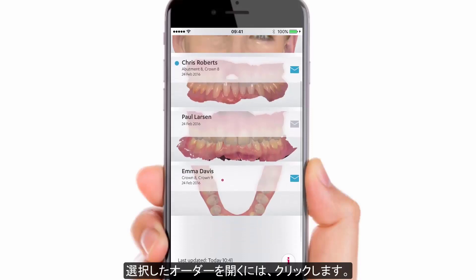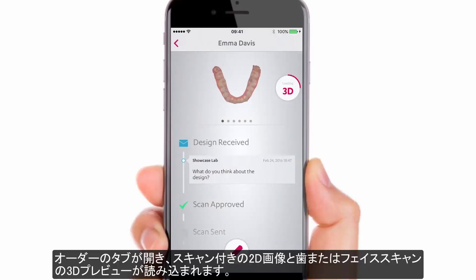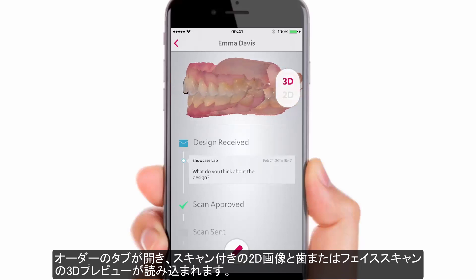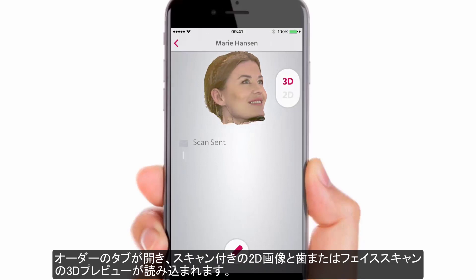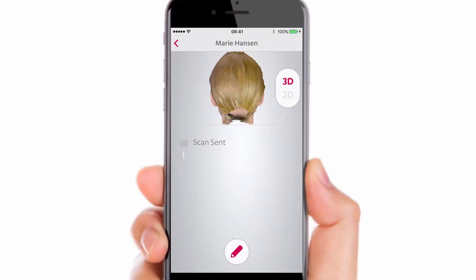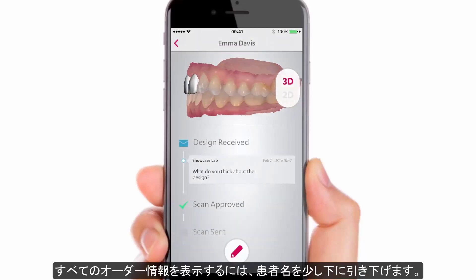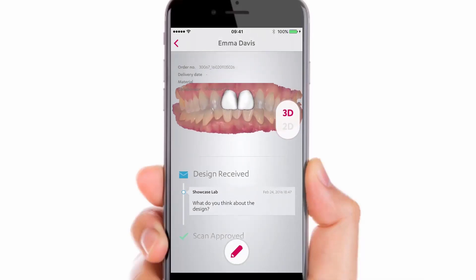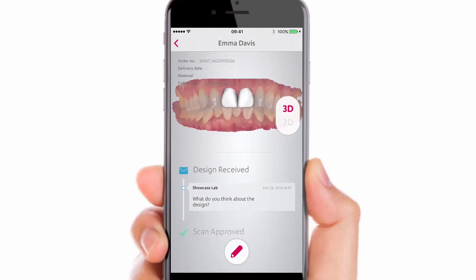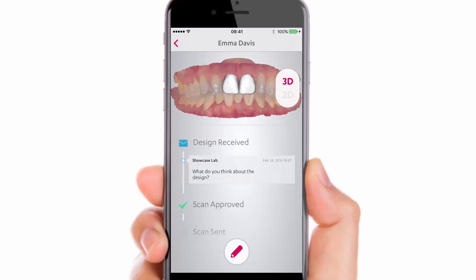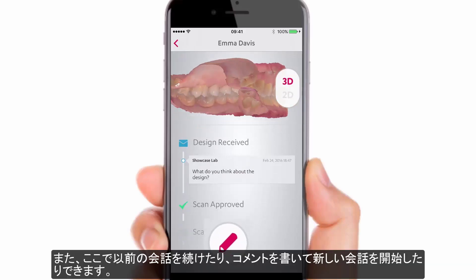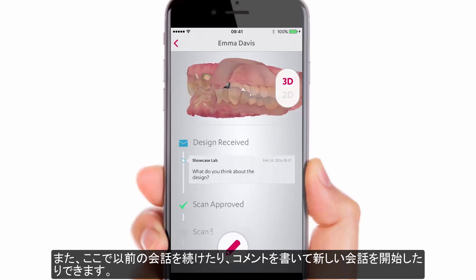To open the chosen order, just click on it. The tab with orders will open, showing 2D pictures with scans and 3D previews of teeth, or face scans, which will load shortly. Pull the patient name down a little to see all the case information. It is also here where you can continue previous conversations or start a new one by writing a comment.